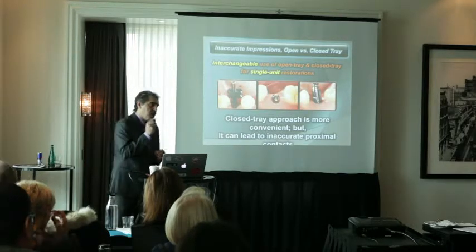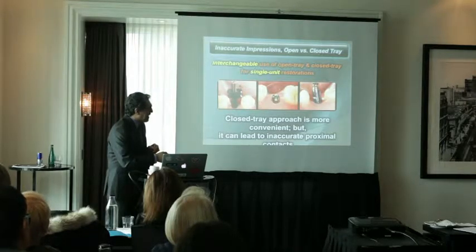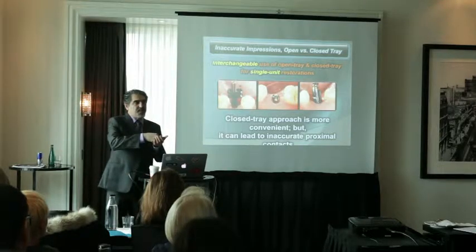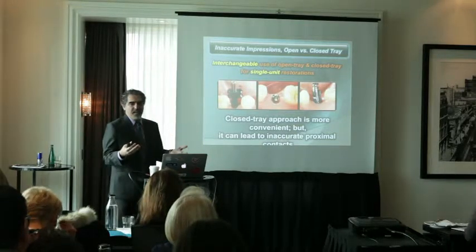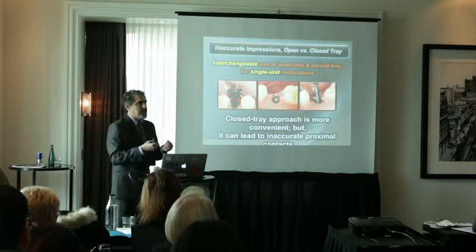If it is one implant, two implants, whatever, if the head is here, don't do it, because later, when you put back the transfer inside the impression, it's going to be very unstable. There are no studies on these sorts of things. It's just a practical thing, and after a while, you get the sense of, well, it's better not to do that.